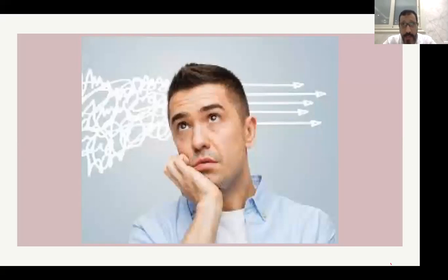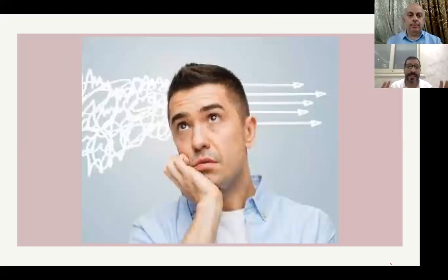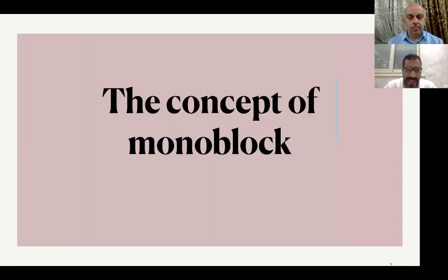Regarding the bioceramic sealer, there is a debate regarding using it with the warm vertical compaction technique. But recently, the companies produced a high flow sealer that you can use with a higher temperature, more than 150. But actually, we have the concept of monoblock, which is based on the concept of adhesive dentistry. You can use a methacrylate based sealer.